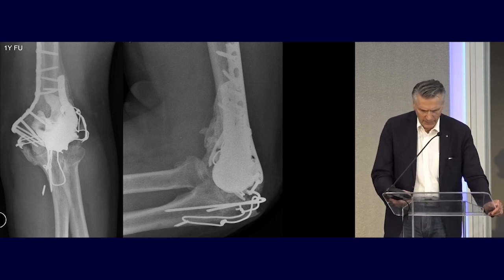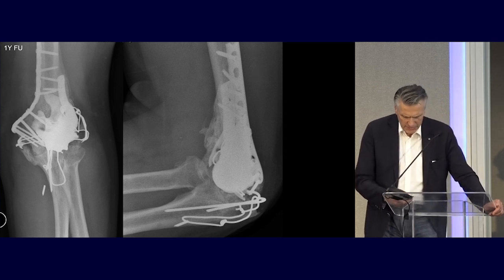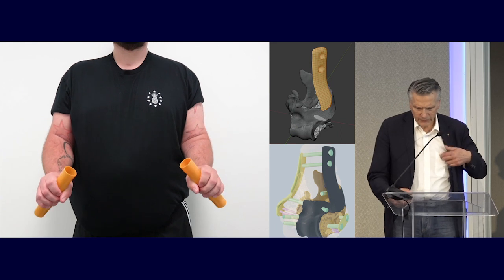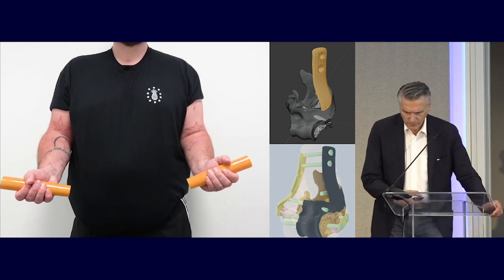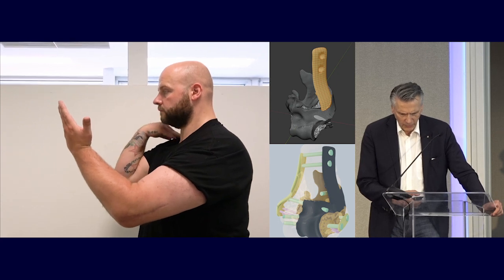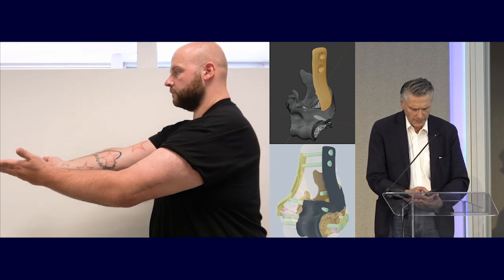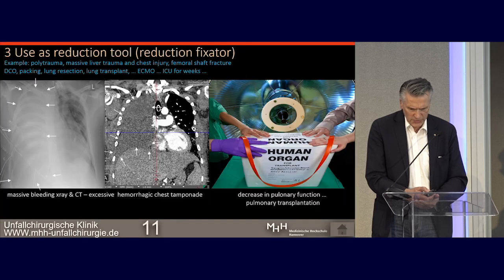The radial capitulum is a little bit flawed in the X-ray, and the patient was healing uneventfully. Here is his function after about 1 year: nice forearm rotation, but his flexion of the forearm is a little bit limited. He comes to 80 degrees and also has an extension gap, but still, I assume, better compared to all other potential options.